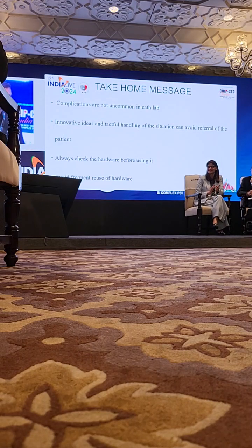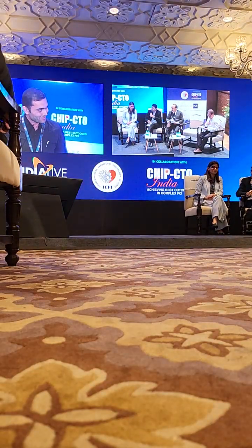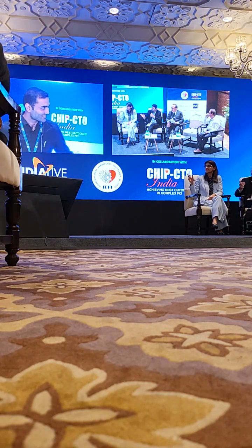The patient was for angioplasty or angiography? Angiography. Then why was the guide catheter used for angiography? Sorry, I mean, a diagnostic catheter was used.